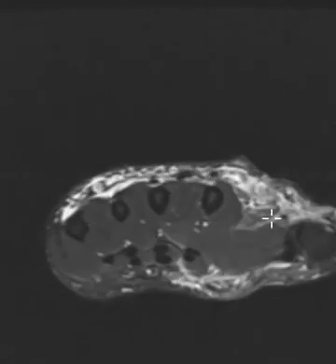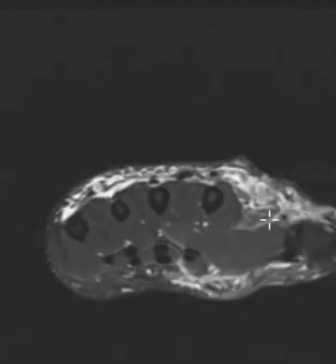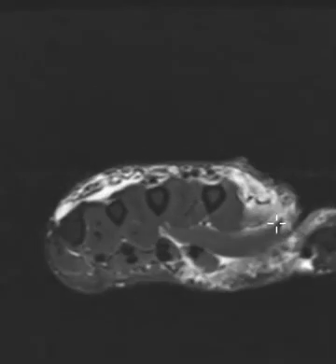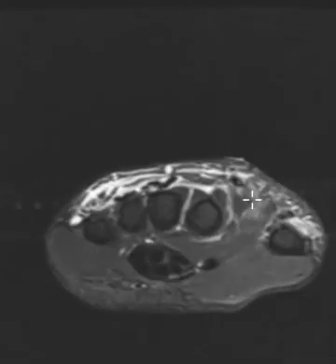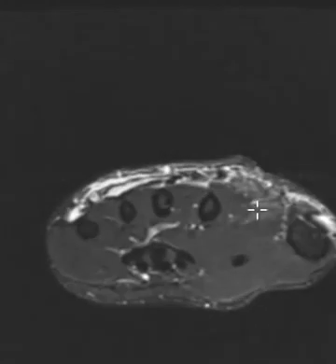It has two components. It has a component that's torn here — it's more radial. It has another component here that's intact, and this attaches to or originates from the second metacarpal bone. The torn component here originates from the first metacarpal bone. If we go down, we can see the muscle belly here, coming off the first metacarpal down here.